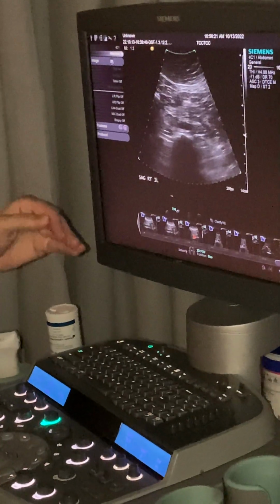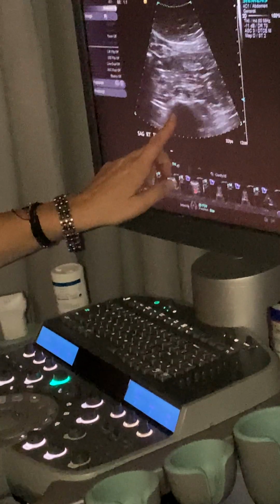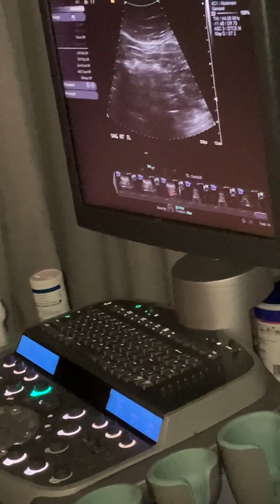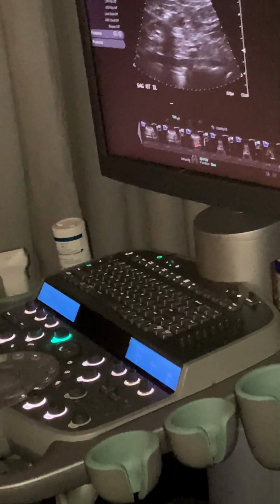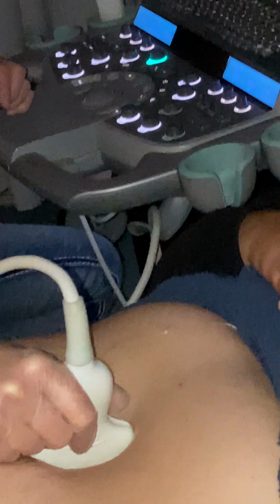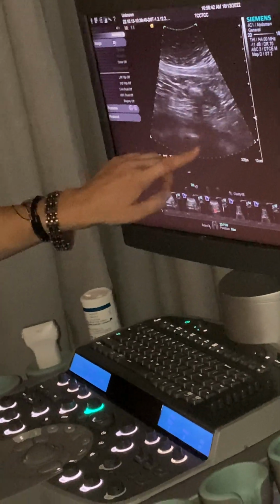I'm moving just slightly inferiorly, and then we have our two little frog eyes. So we've got the spinal process, we've got these two little eyes. So we could follow one of those. This is that sag to transverse, which is a little bit tricky for you guys right now. So what I would recommend doing is kind of sitting on that distal aorta, and then see where it's tapering, and then move the bottom of your transducer one way.